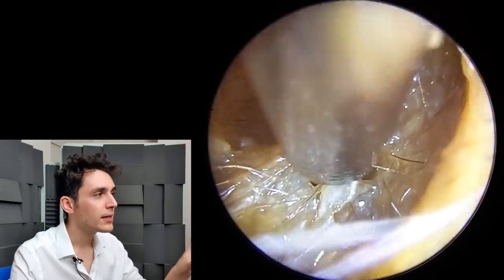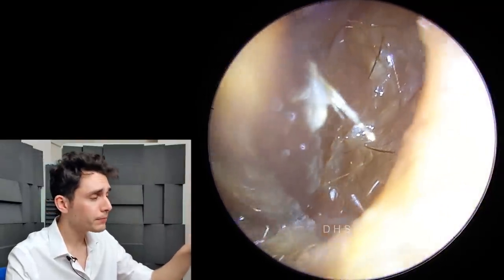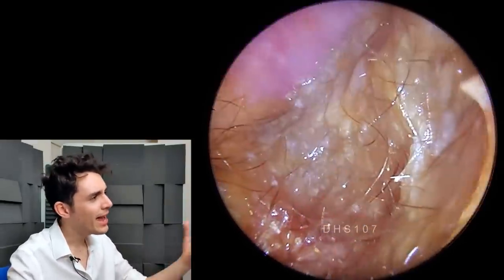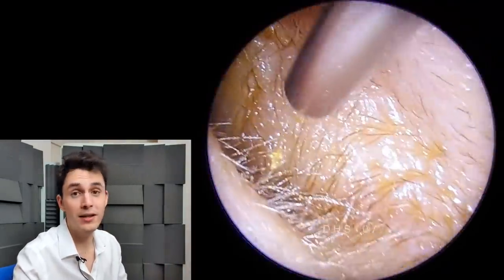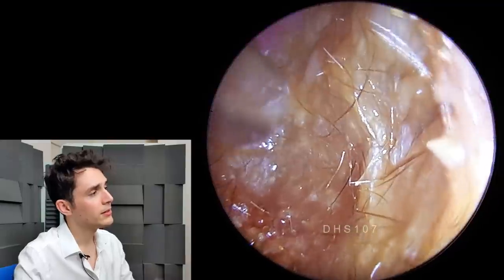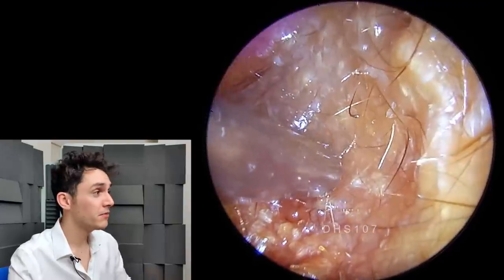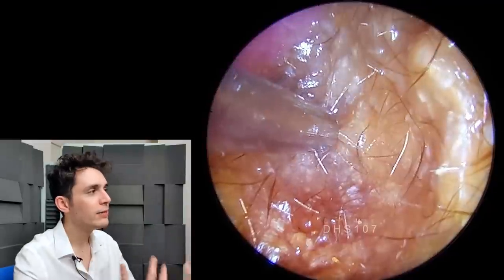So we're going to irrigate this ear canal with water. The suction is doing a lot of the heavy lifting, but what you can see here is that the ear canal is coated with this very, very thick, viscous, hairy slime, which is a nightmare, because that's exactly the type of wax that is heavily resistant to suction. The suction is cranked up to minus 550 millimeters of mercury — so it's very powerful — and yet this slime is really resistant to it.